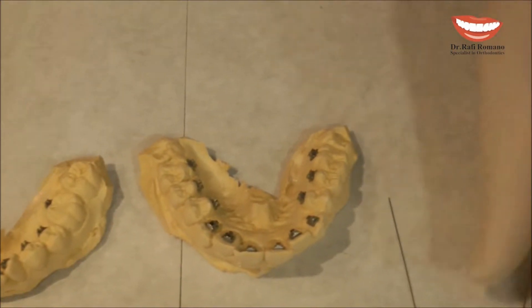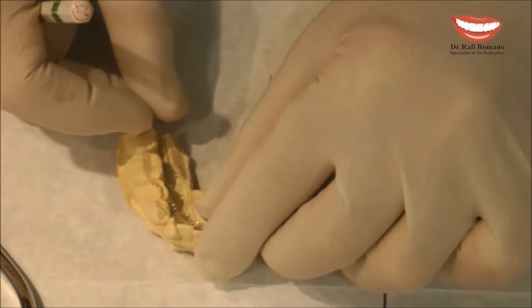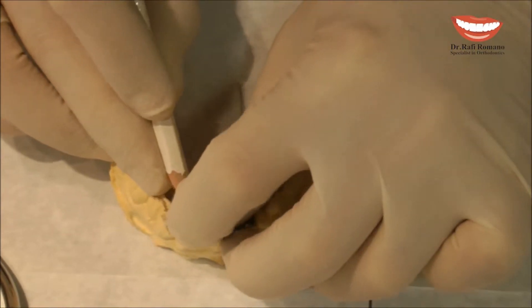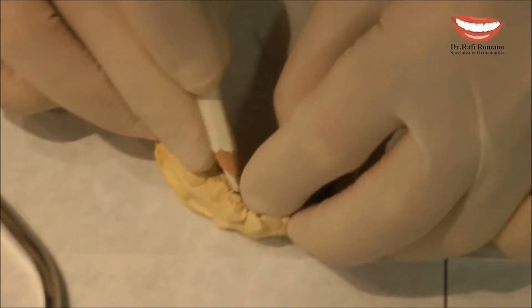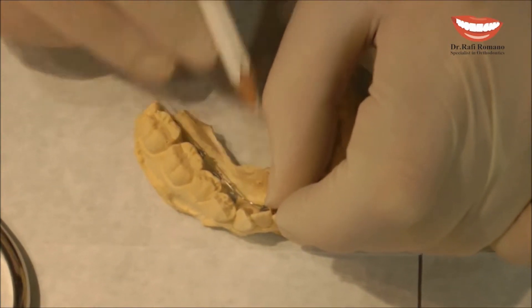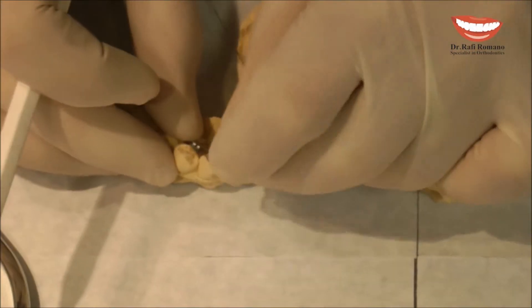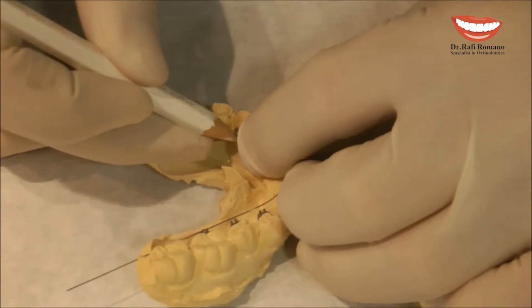I take the wire, I place it in the anterior part and I mark my mark on the wire in the middle of the premolar. Not between these two teeth, not close to the premolar, but in the middle of the premolar. Then I do the same on the other side, in the middle of the premolar.